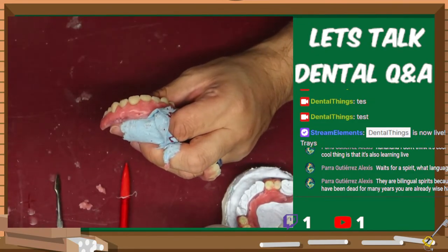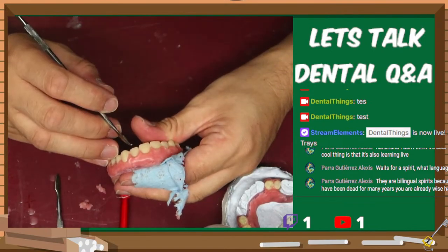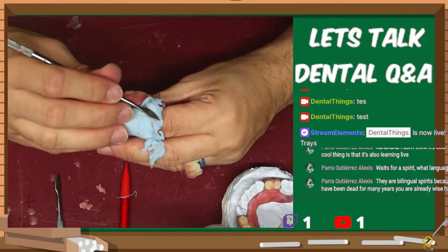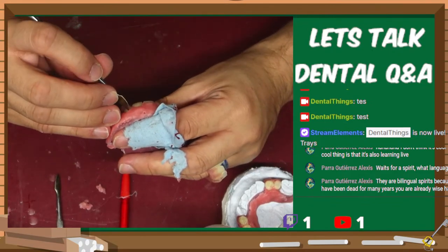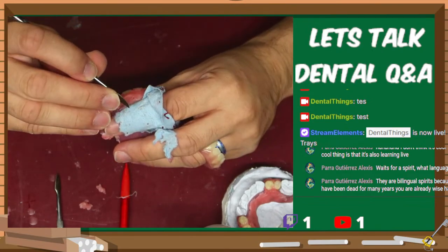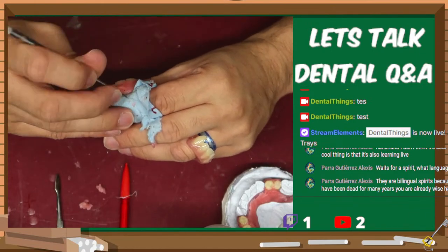Alright. I like this side, showing more tooth than gum. The previous version I had was just too gummy in its smile. And so I think I found a nice little happy medium for these ones. Maybe a little bit more tooth for the central. Yeah, that's about what I want.